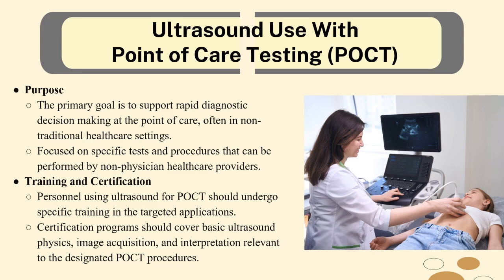You've got to send them to triage or urgent care or the ER to be accelerated in that ultrasound scheduling system. Versus, you can grab the machine and confirm the baby is head down, she's in early labor, especially in OB triage and intrapartum management. Having point of care ultrasounds is really, really helpful. You have a low-lying placenta, there's some abnormal bleeding, there's a history. You can make decisions very quickly in these urgent care settings when more concerning symptoms arise.